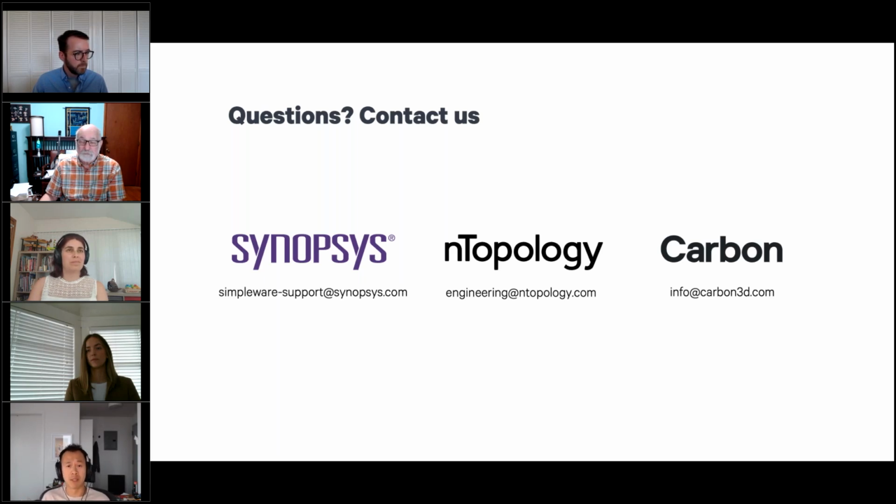A lot of the workflow design process is based on reference points, those landmarks that Celia gave us from the Synopsys side of things. These references are critical to accommodate when you're first designing that workflow. So in short, I would recommend designing a workflow for every major component or joint area and just keeping it segmented like that.